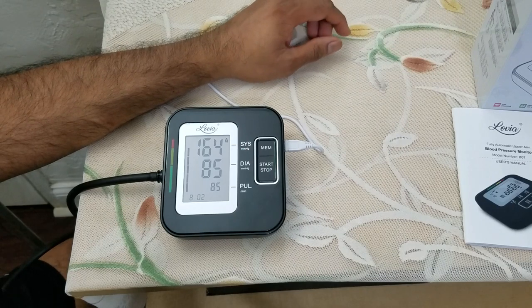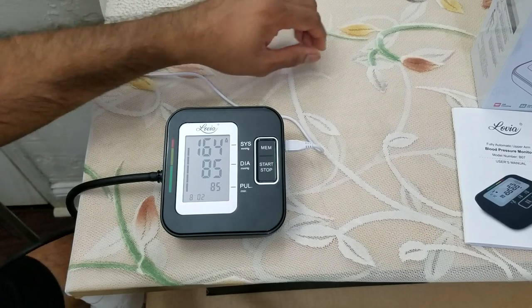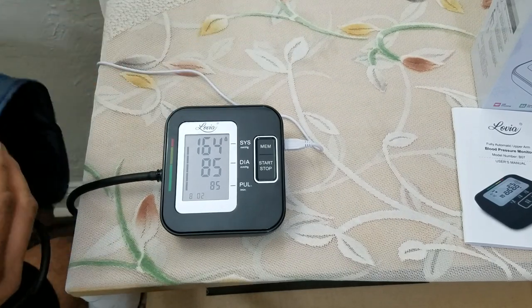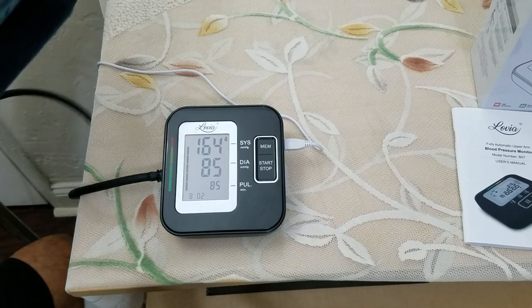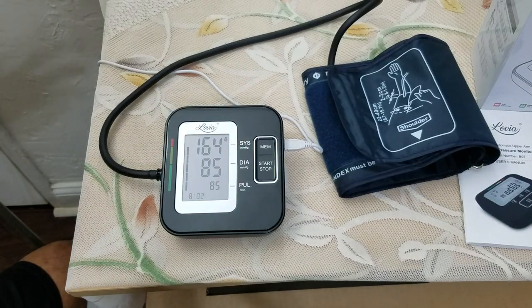The reading is 164 over 85. I was working on the lawn so it's a little bit high. Normally you should be doing it while you're rested, or when your heart rate is not up because you've been working outside. Definitely a good product — a great Christmas gift or holiday gift for your parents or any elders in your family.